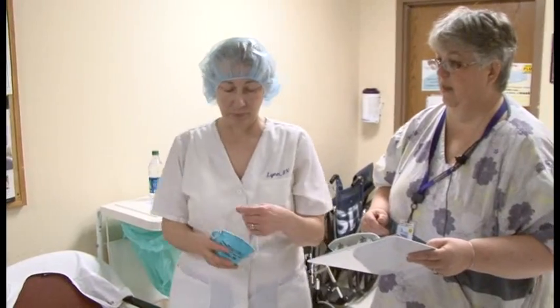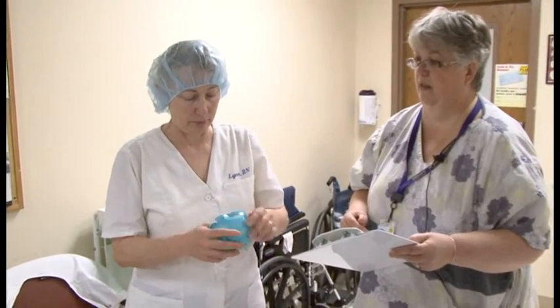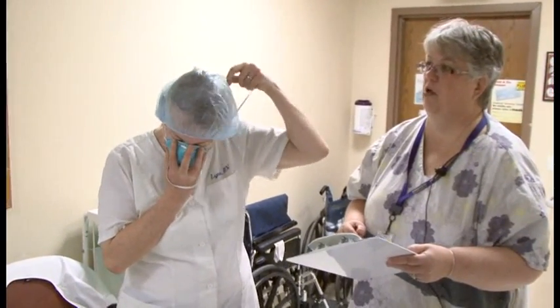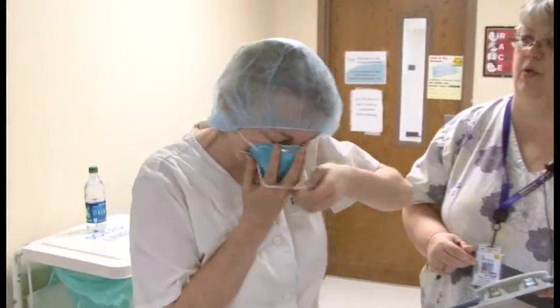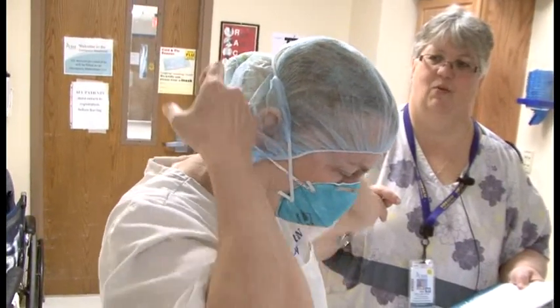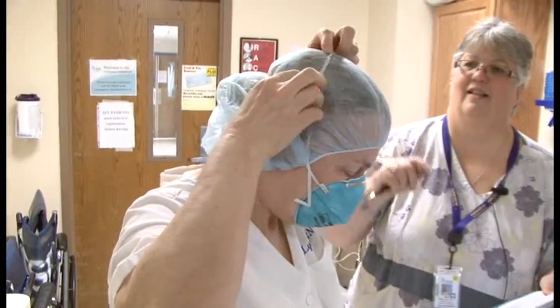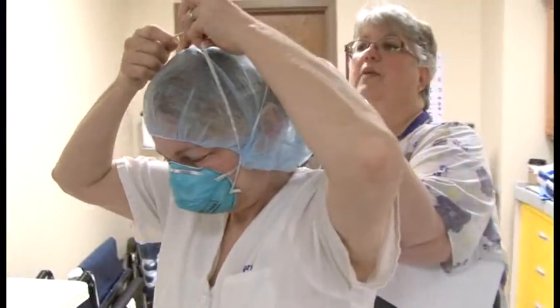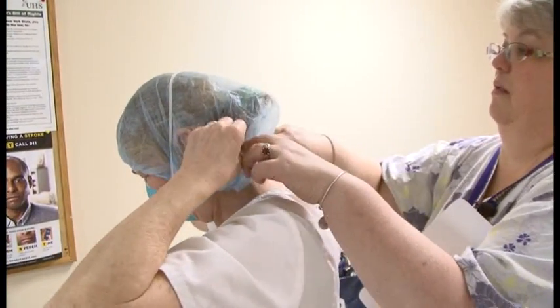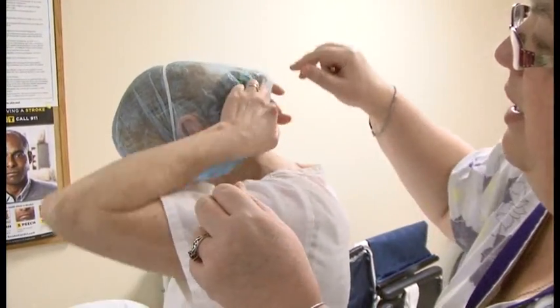The next thing Lynn needs to put on is her N95 mask. It's important that one of the top straps goes at the crown of your head and the bottom strap goes to the base of your neck. The observer can actually get their hands on there and help get the mask on correctly. Then Lynn is going to perform a fit test to make sure she has no air leaks.